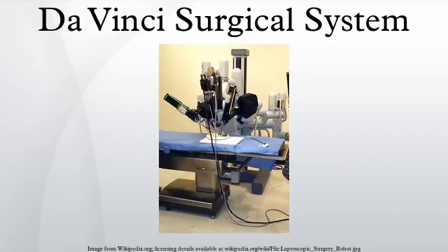The manufacturer of the system, Intuitive Surgical, has been criticized for shortcutting FDA approval by a process known as pre-market notification, which claims the product is similar to already approved products. Intuitive has also been accused of providing inadequate training, and encouraging healthcare providers to reduce the number of supervised procedures required before a doctor is allowed to use the system without supervision.